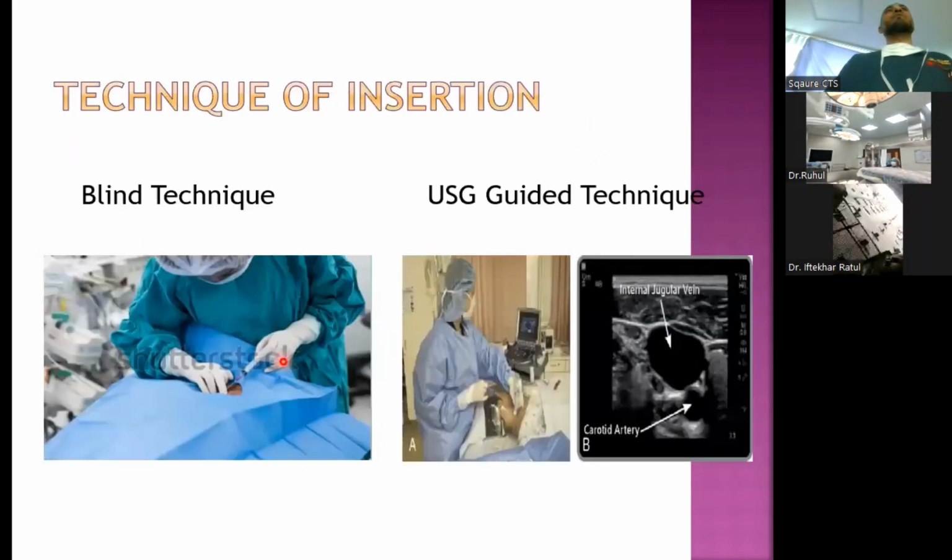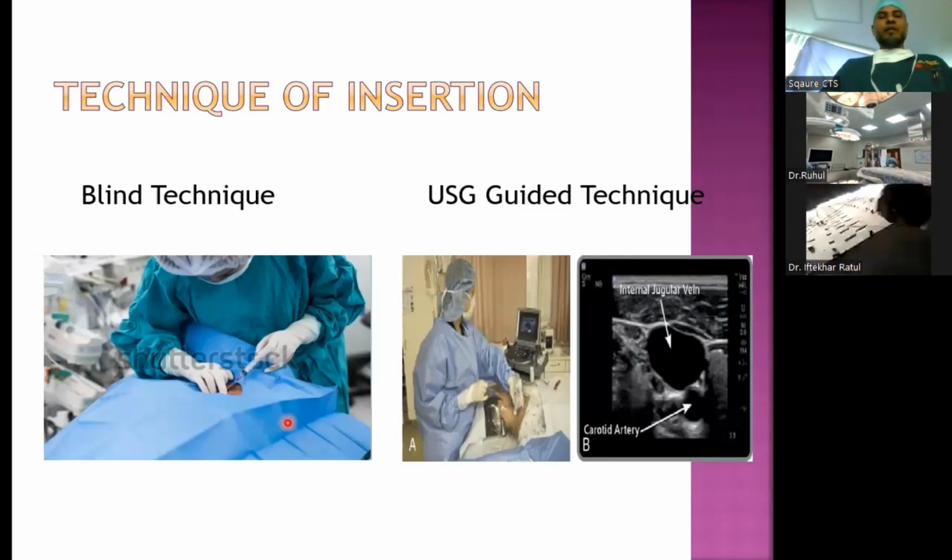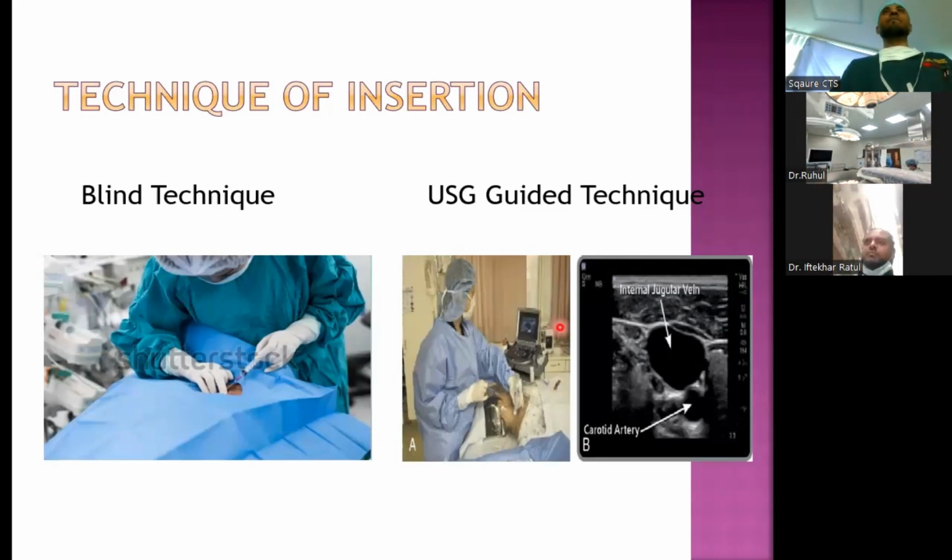For the technique of insertion, we usually use the blind technique and the ultrasonoguided technique. In most countries in the world, they are nowadays using the ultrasonoguided technique. This is the ultrasonoguided technique.